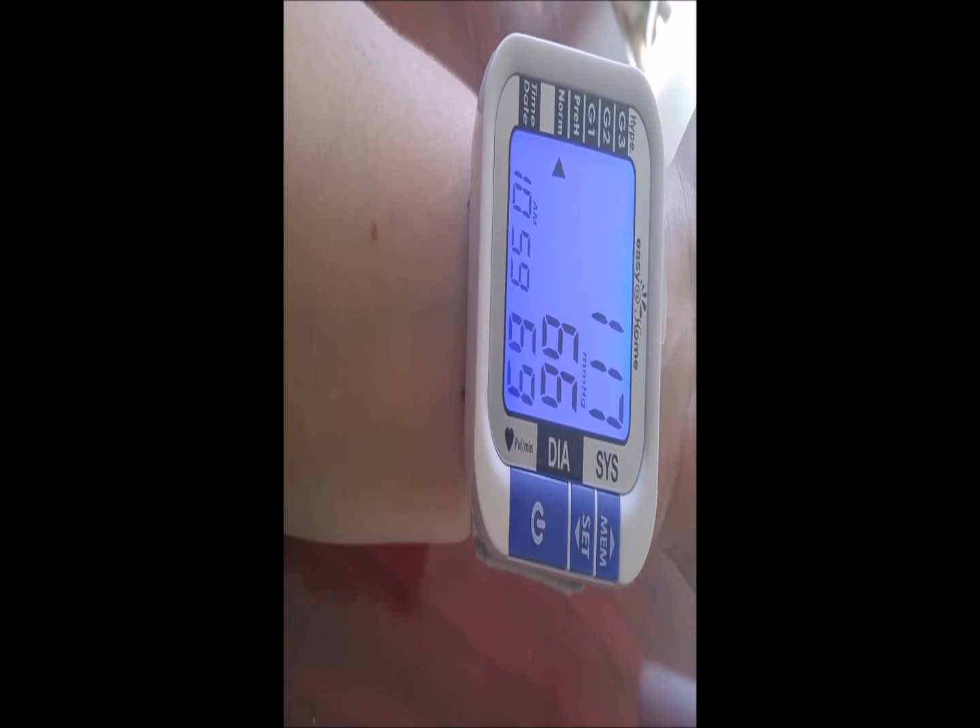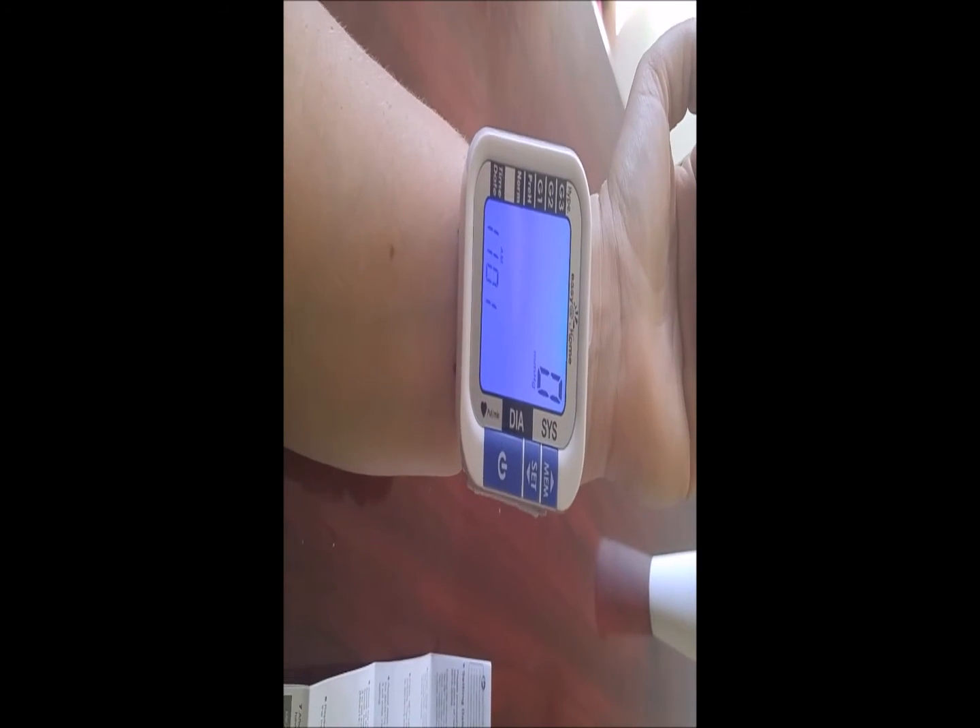As you can see, it is quick and easy. That is my reading. All you have to do is hit the power button and it starts immediately, so do not hit the power button until you are ready. I am normal. I am going to begin a second reading so you can see how to pull up memory and previous readings.